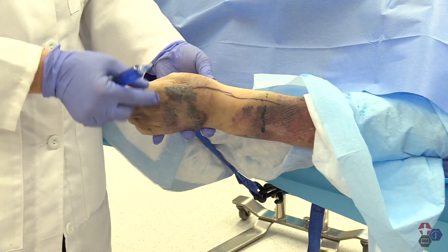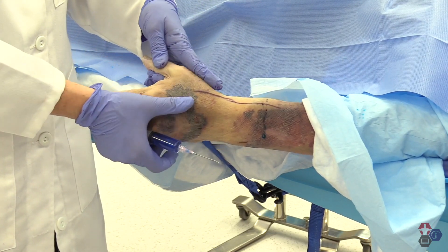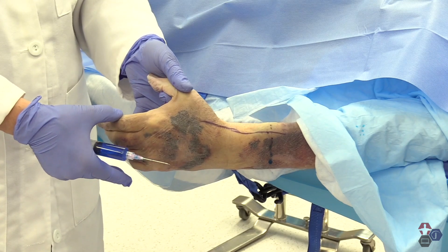That block is going to take out all of the dorsal web space between the first and second metacarpal, the entire thumb, the entire thenar eminence, and half of the index finger.